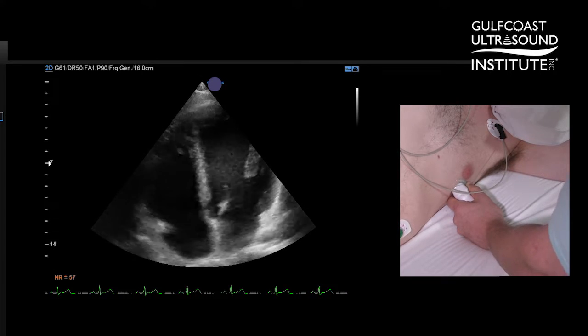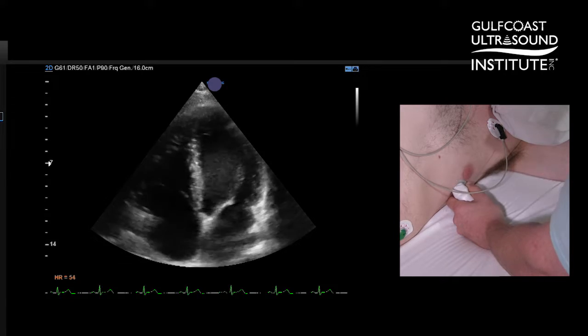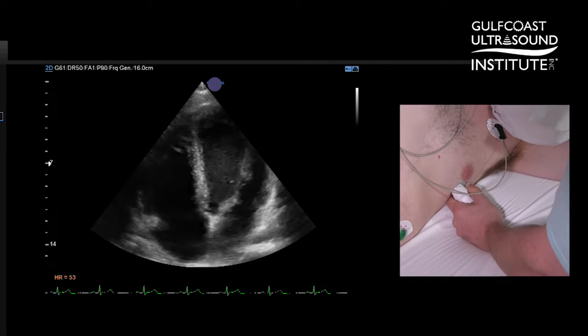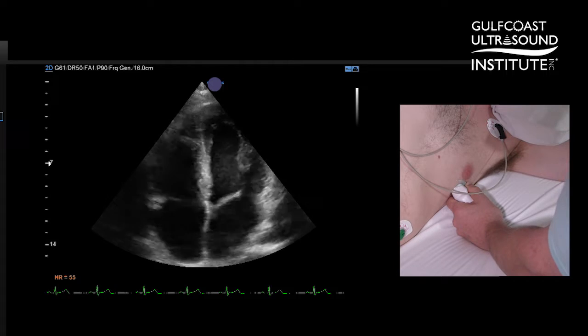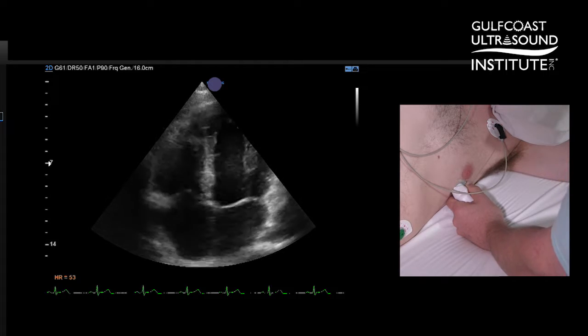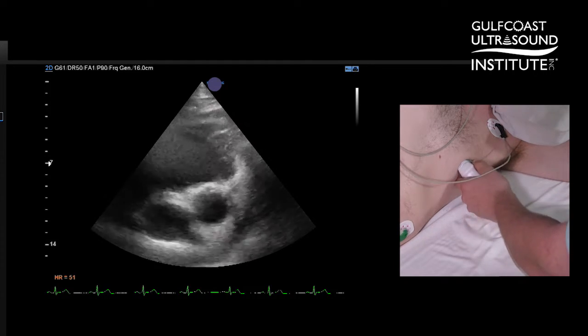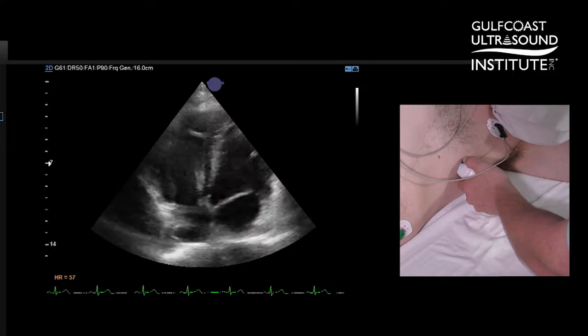If we see that the RV apex on our screen is lower than the LV apex, that tells us that we're on axis for an apical four. But in these instances I may actually slide a little bit off axis.